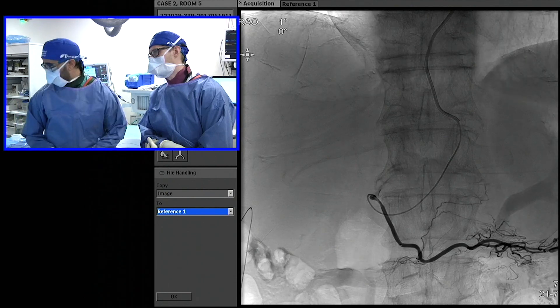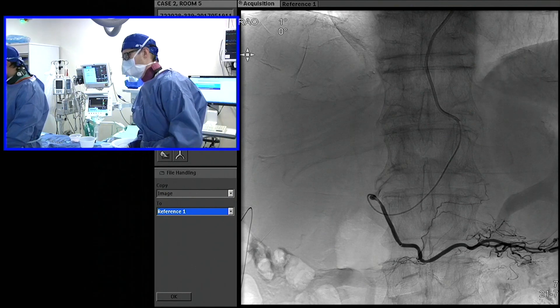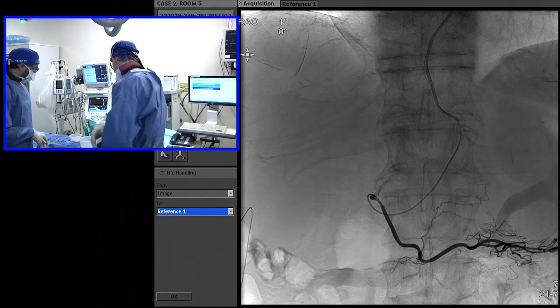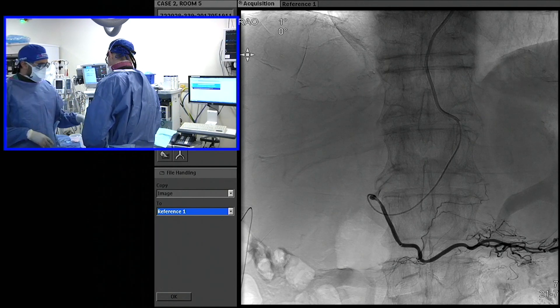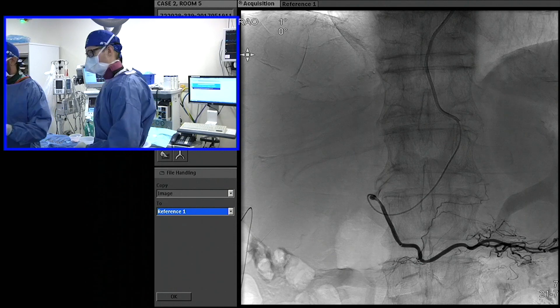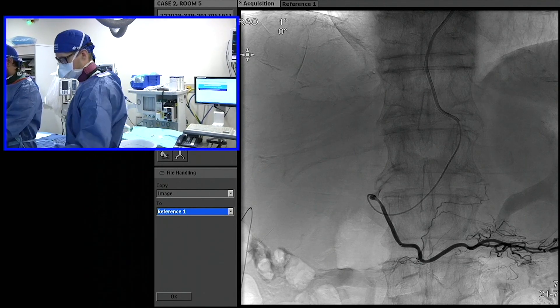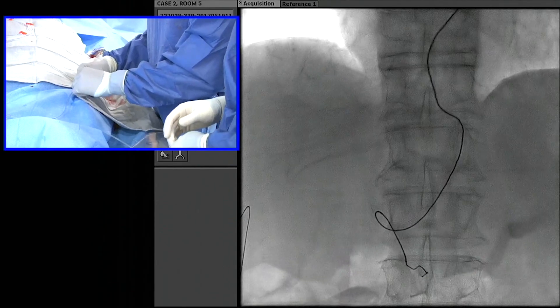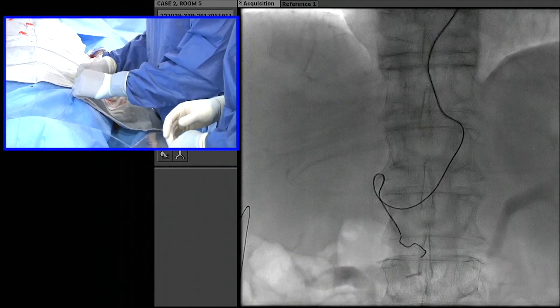What we're going to use is a POD from Penumbra — we're going to use a 4. It might be a little big; it's rated for a three-and-a-quarter-sized vessel as the minimum. It's probably a little on the big side, but we're going to see if we can push it. You can see it's going to spaghettify here because it's probably a little too big, and it's going to push us out.